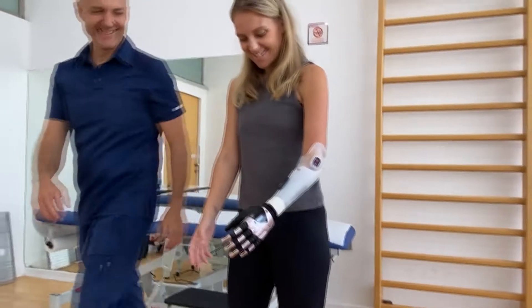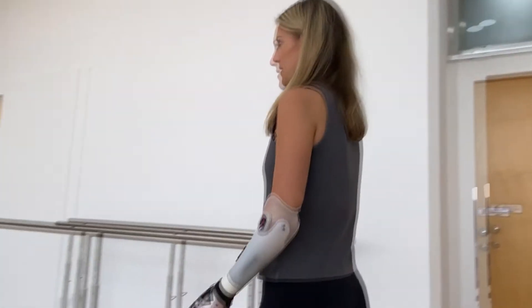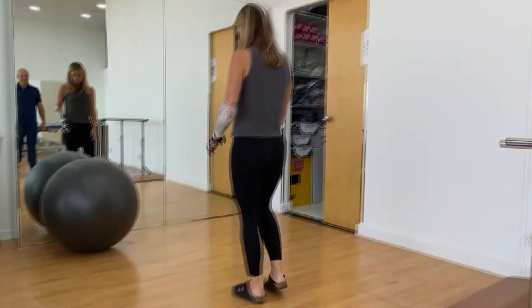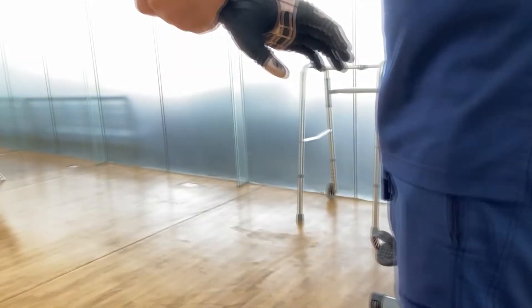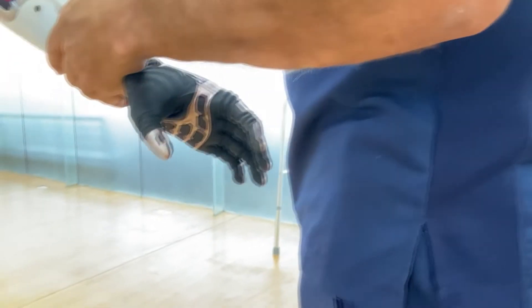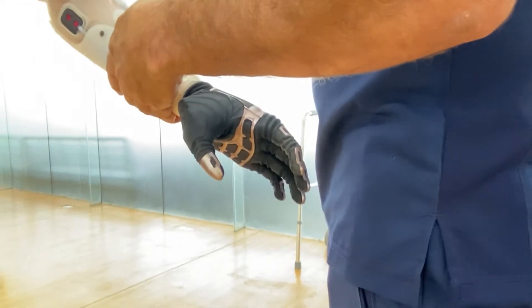You're going to walk — just walk, okay. Are you straight with your arm or are you scared? I'm scared. Very close — close your hand. Try again, that's it, perfect. Okay, open it all the way. Okay, that's fine — extend again. Okay, good. Open, close.